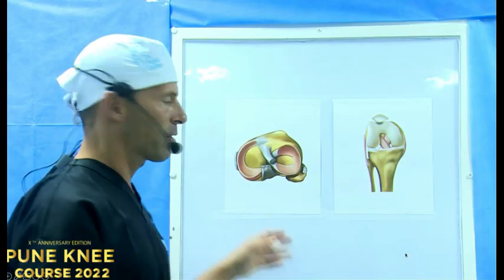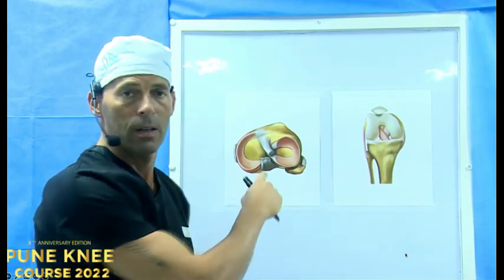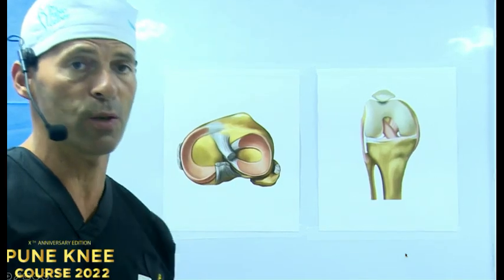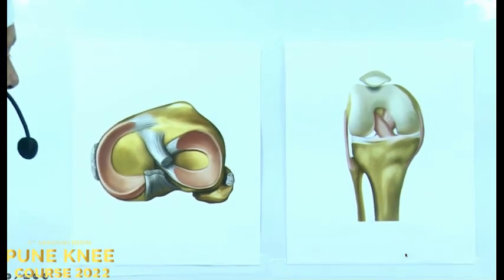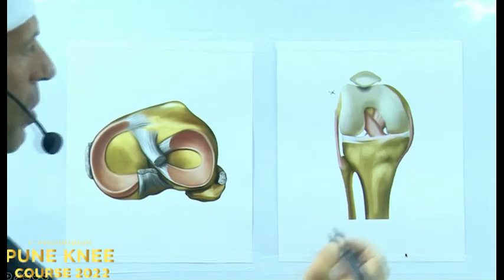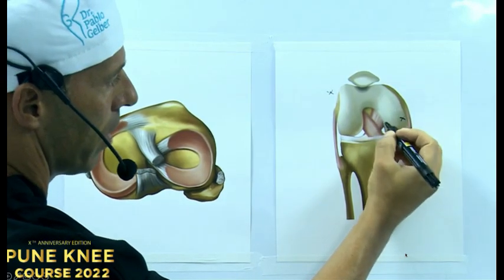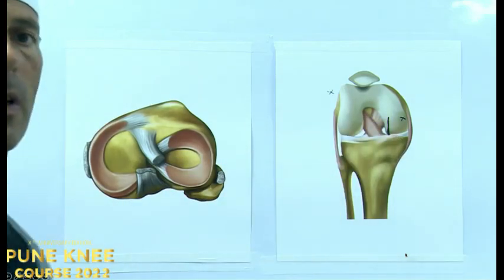Hello everyone, this is a case of medial meniscus deficiency in a normally aligned knee. So we will address a medial meniscus transplantation here. We will perform an only soft tissue technique. In this way, mismatching of the allograft with the patient is not a big issue. We will start by performing three portals: one high anterolateral for good visualization, and then two medial. One more medial than the other one, right here, and the other one will be a large parapatellar medial portal, large enough to fit my fingertip inside through the portal.